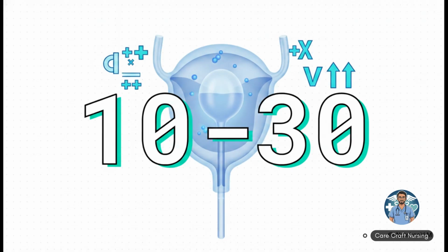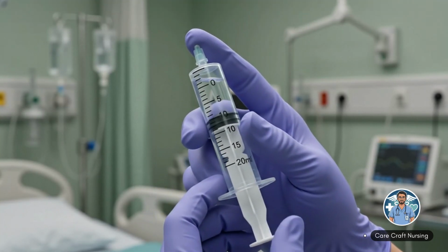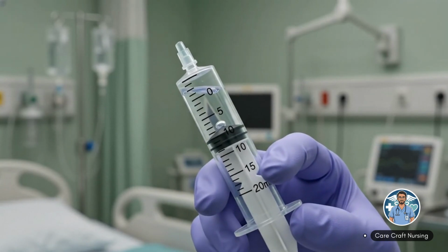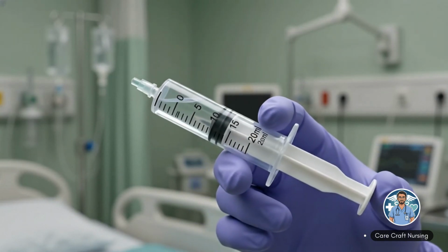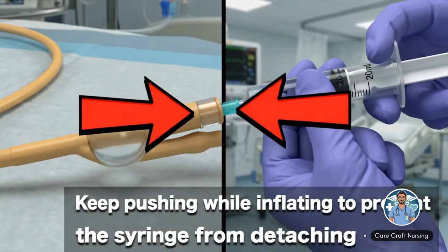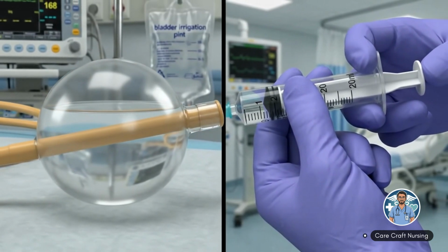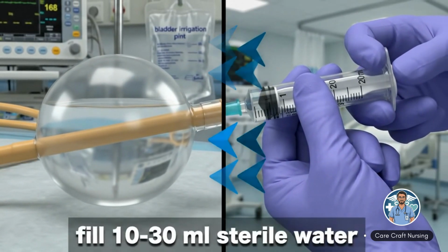And right alongside that sizing data is this magic number, 10 to 30 milliliters. Once you have that catheter perfectly positioned in the bladder, you're going to use between 10 and 30 milliliters of sterile water to inflate the balloon through that inflation port we talked about earlier. This balloon is exactly what anchors the catheter safely inside the bladder so it doesn't just slip right back out.